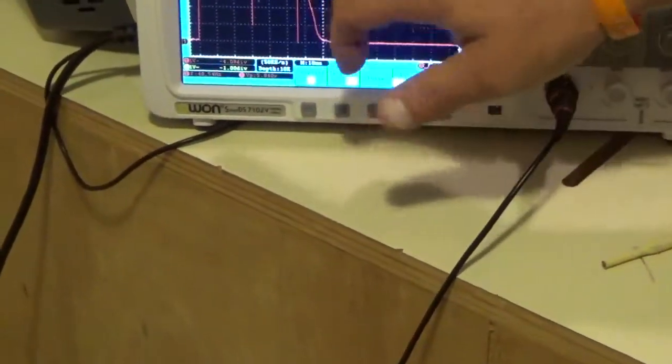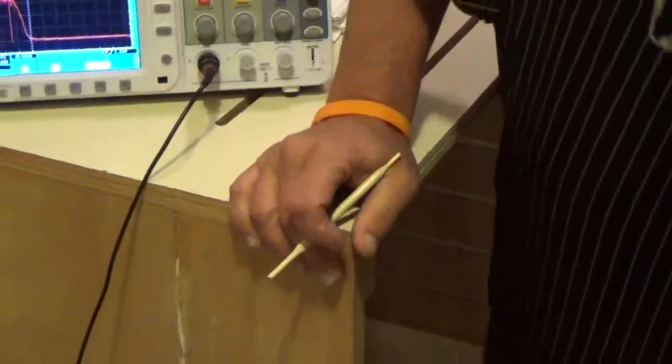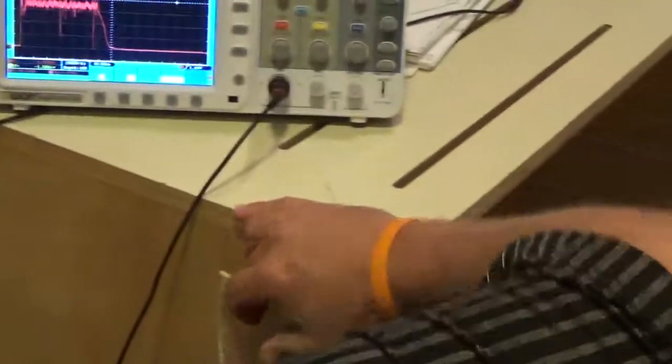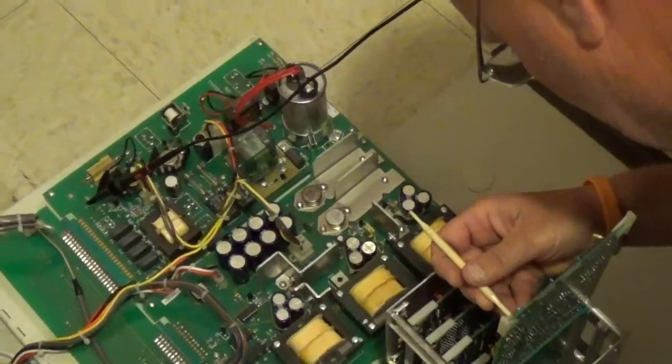Okay? So we're counting this up. Right now we're just worried about preheat for the moment. So let's take that R63, which is your preheat again. Let me read it again, make sure. R63, and we want to just go up just a little bit on R63 to kind of flatten that. And we may get a teeny little bit of overshoot on the low power, but I'd rather have overshoot under that R72. Yes, that yellow one right there. We want to just bring it up. Give that a shot, yep. So we're going to tweak that, take another shot, come back.